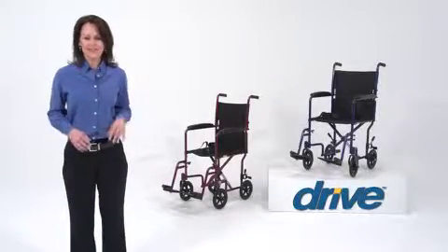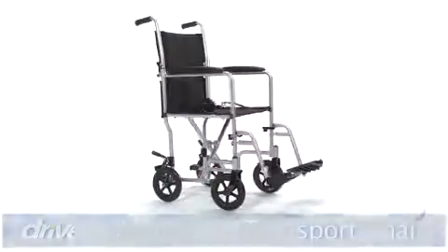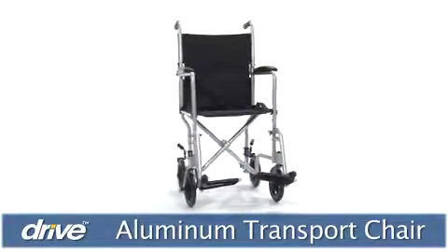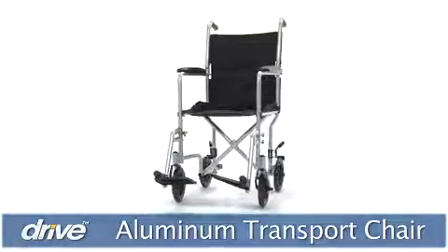Special outings and everyday activities with friends and family are part of life's great pleasures. Drive Medical's aluminum transport chair gives people with limited mobility a comfortable, convenient, and affordable way to go anywhere with the help of a companion or loved one.